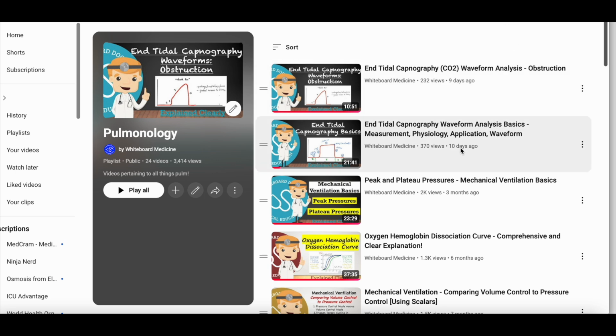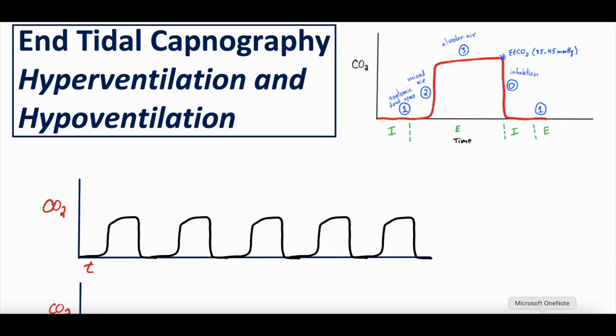This is the introduction video on end-tidal capnography, particularly waveform analysis basics. If you're new to end-tidal capnography, we would recommend you start with this video because it'll give you the setup for how to understand the rest of the videos today. If you are familiar already with end-tidal capnography and you're just looking for hyperventilation, hypoventilation, this is the video for you.